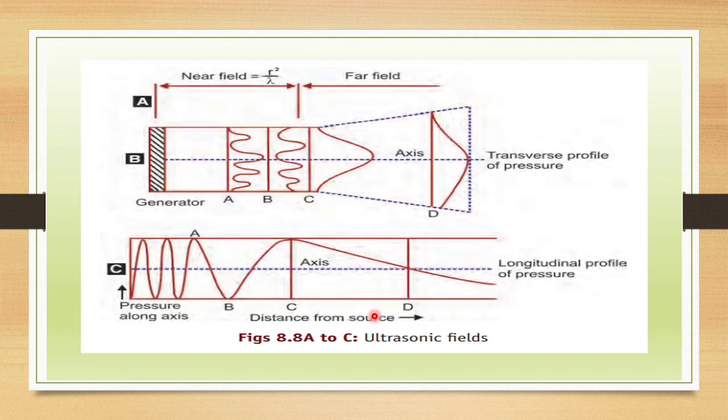So this is another pictorial representation, and it has been classified into transverse compression or longitudinal compression. So compression, alternate compression and relaxation in a longitudinal pattern, and alternate compression relaxation in a transverse pattern. If you are giving a treatment towards your bone, once the ultrasonic wave is almost going to reach the bone, means in the bones it will be moving.